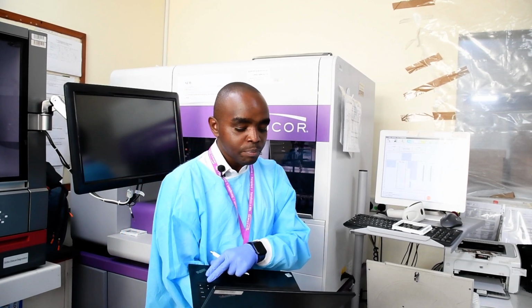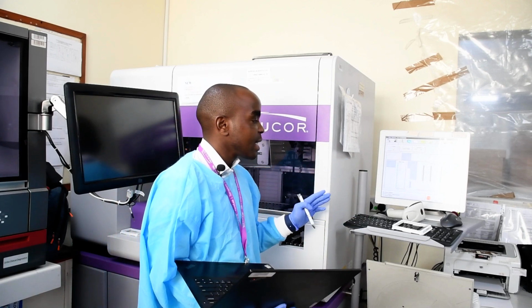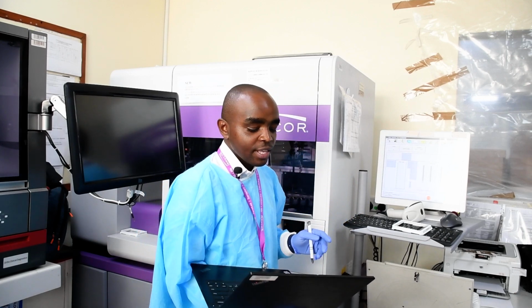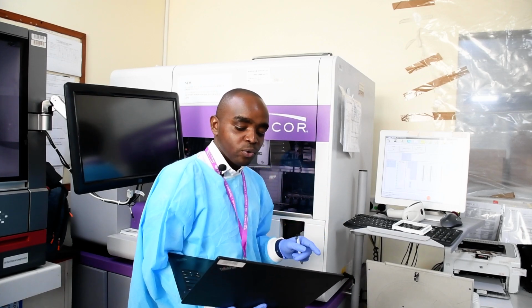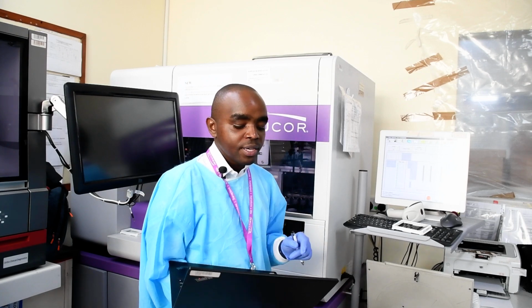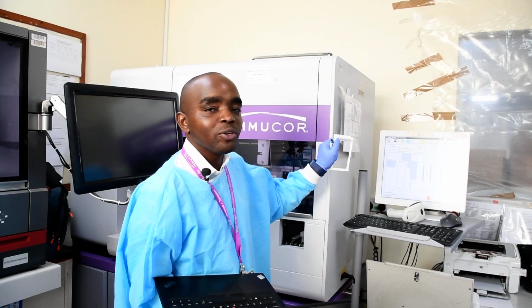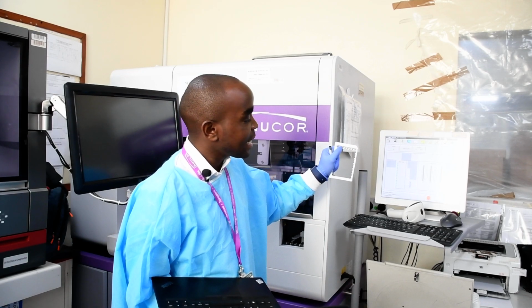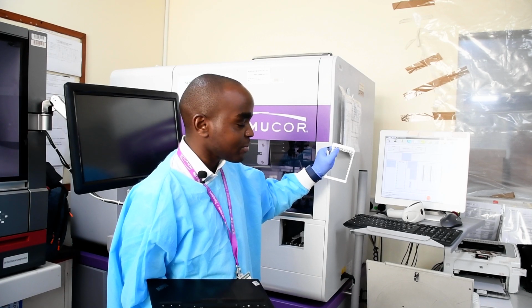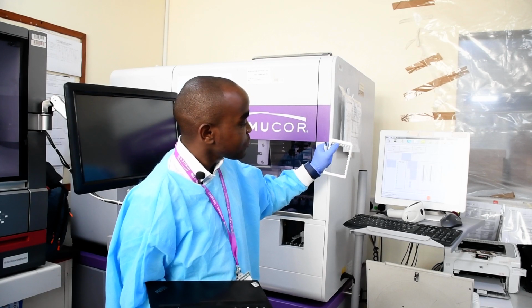So, for example, we say here that the titer for this ABO, anti-A or anti-B, either IgM or IgG, is the inverse of the dilution at which the endpoint agglutination is +1. For example, you have started with your main plasma here, and you have serially diluted it. For example, this is 10, 20, or 40 there.